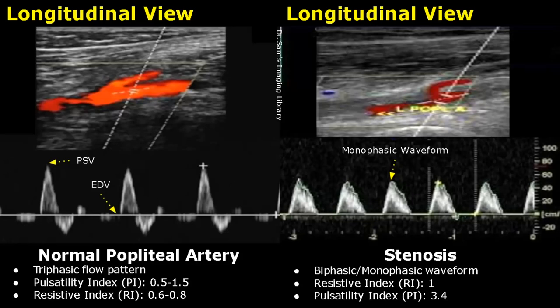The normal waveform can also change to biphasic or monophasic in a normal individual after exercise, so these features are always correlated clinically.